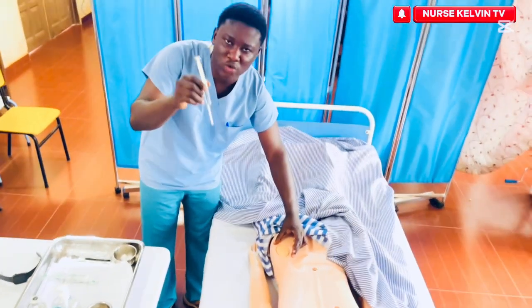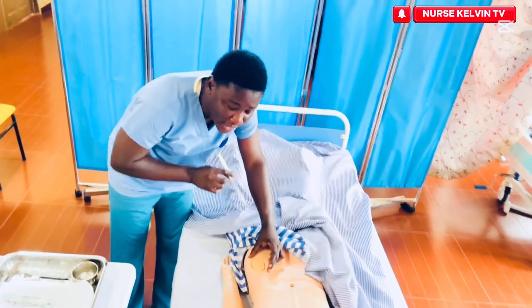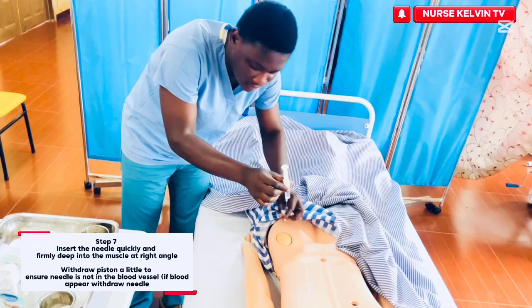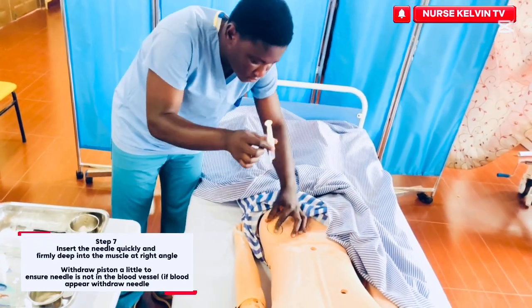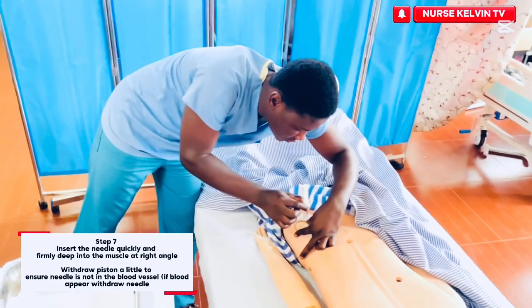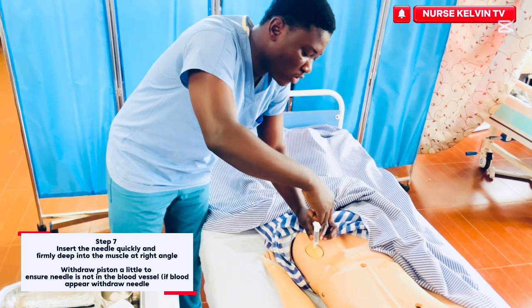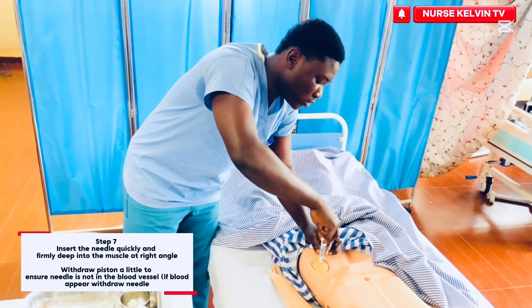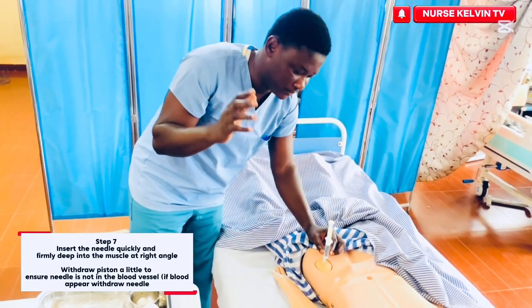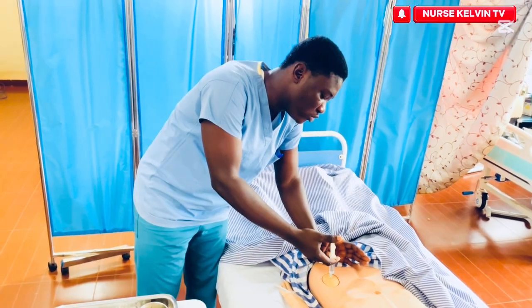One thing that you need to know with IM medication, we go 90 degrees. You need not go like this, go like this. We go 90 degrees. You squeeze the place like this, then you go 90. You draw small and see. If there's blood coming here, you need to stop. If there's no blood, then you're supposed to go in. So go.